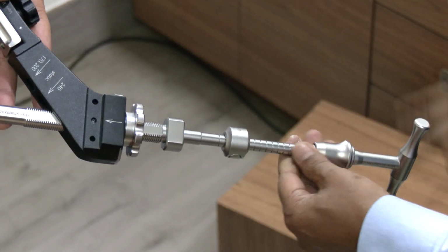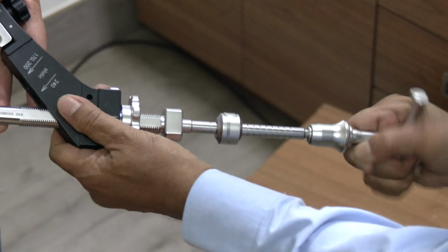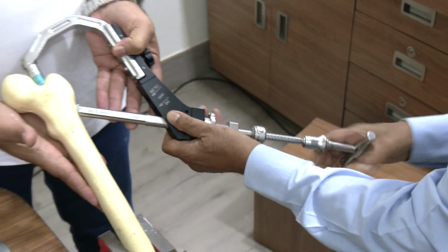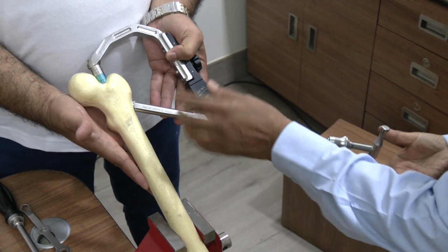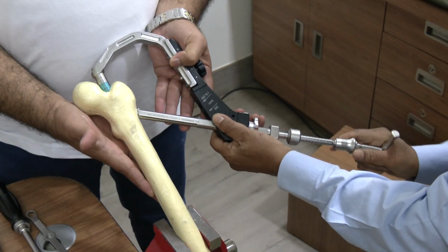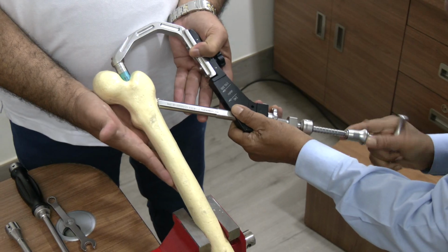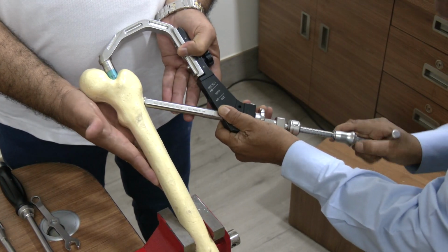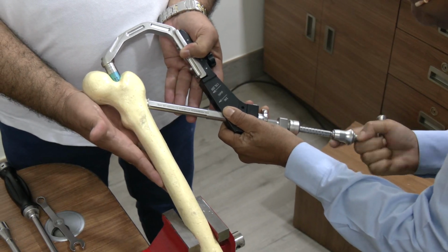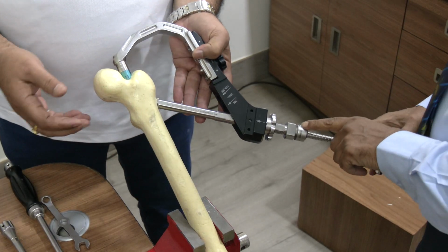You see, I am not passing in this direction, but either with a to and fro motion or using only the anti-clockwise direction. The reason is whatever bone this reamer drills and takes out will all get pushed to the periphery instead of coming out along with the step cut drill. So in an osteoporotic bone, this is a very useful step. I have done it up to 80 millimeter.